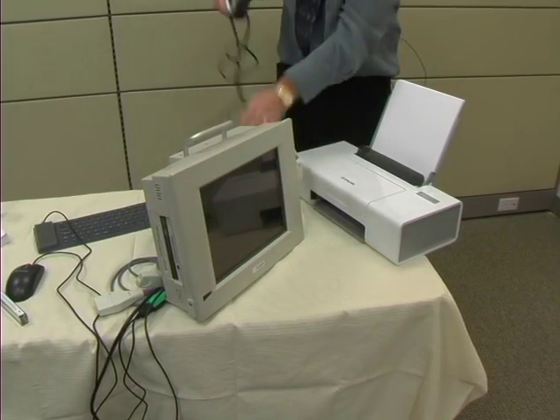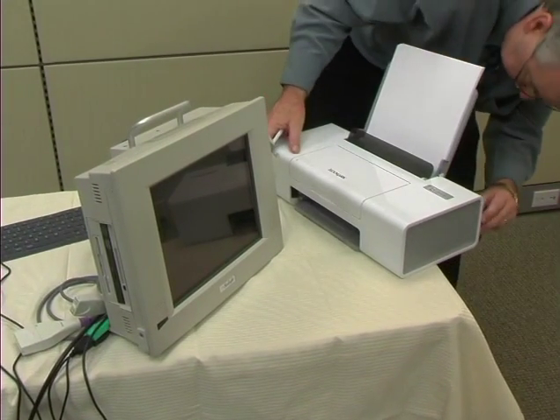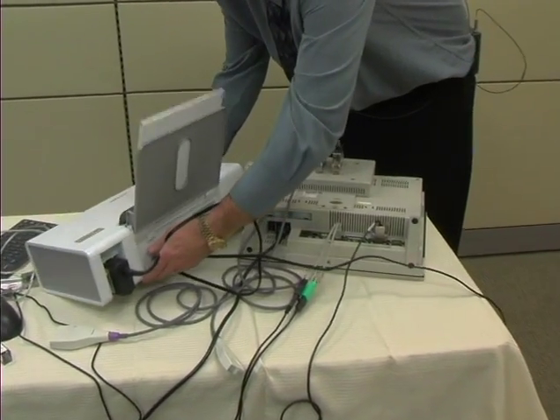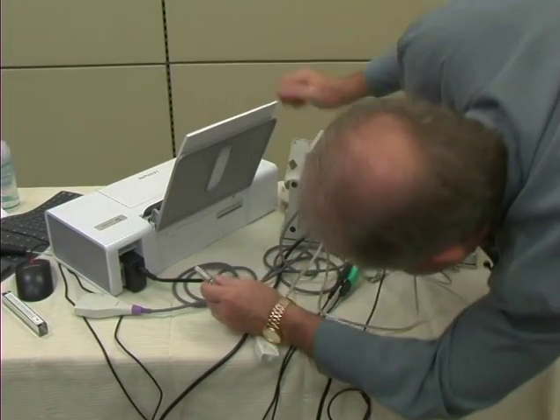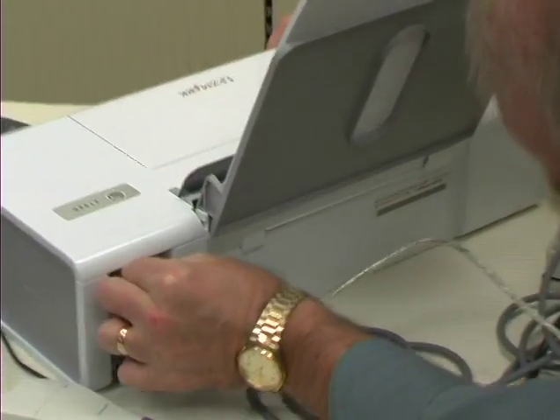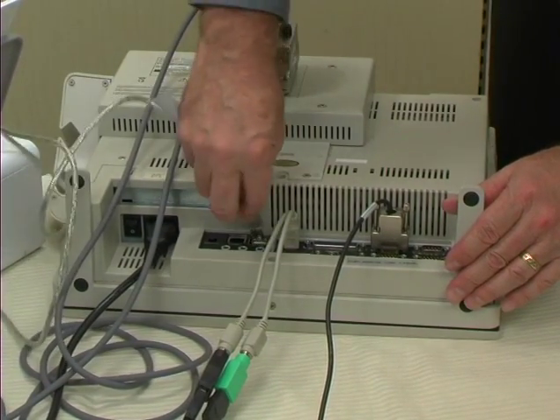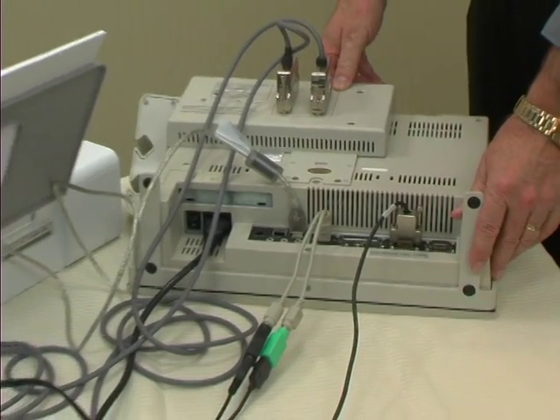We have the power cable for the printer, which goes into the back of the printer. Now we want to attach the printer, and we need to do that with the USB attachment — one end fits into the back of the printer, and the other is a USB connection. There are two USB ports in the back of the unit, so we're going to use one of those. There we have the attachments all set up.